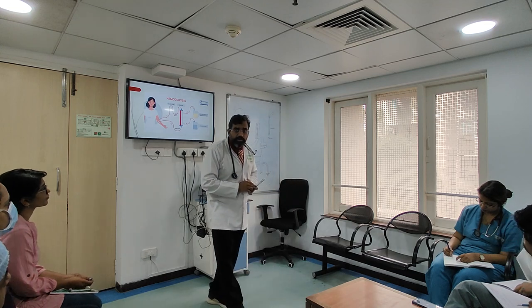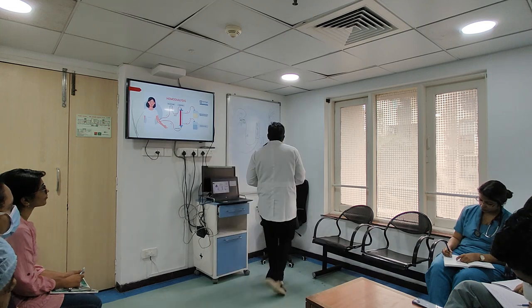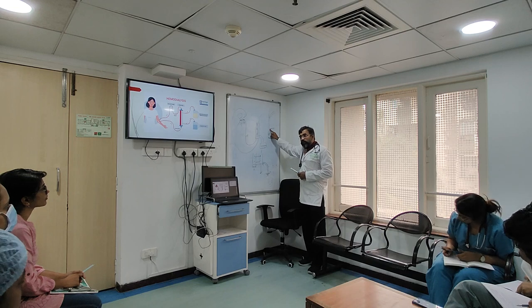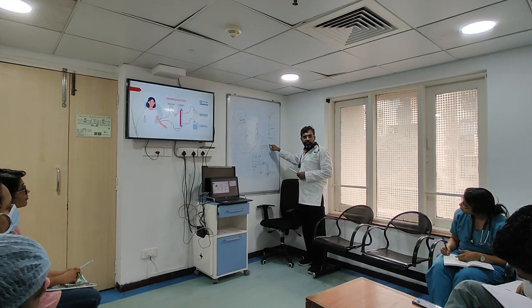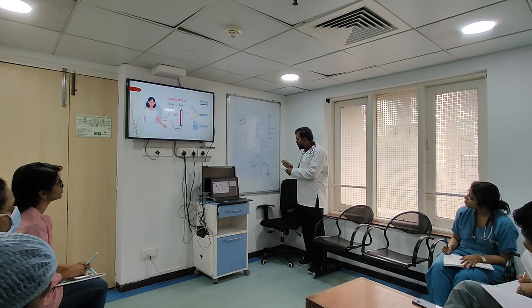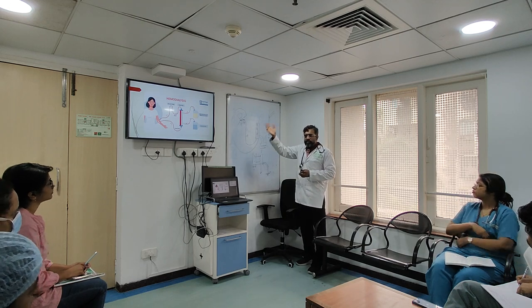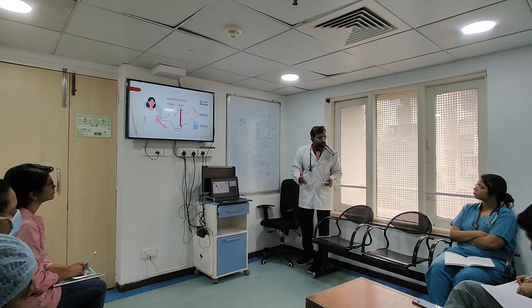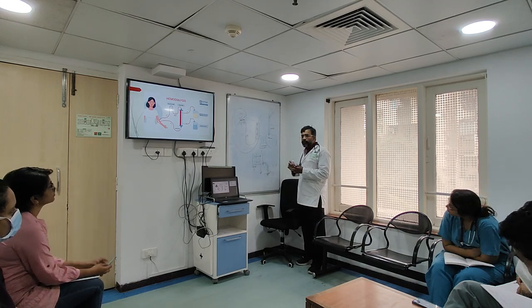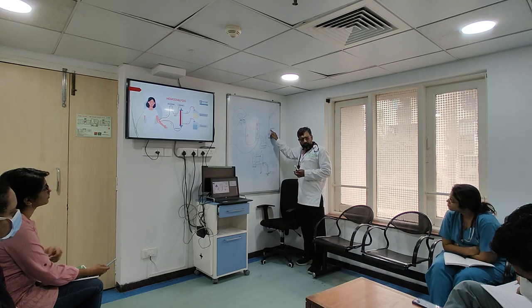Because classically I want to take fresh blood from the body, and that is why I want to take my blood from here, whereas I want to give my return blood here. Are you understanding? Both of them are going into the heart only, right? But they are coming from the SVC and IVC, from different parts. I want the dirtiest blood, if I would call it that way, to come from the top, no?